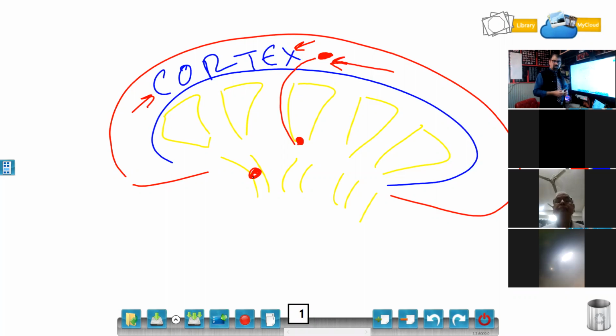You better know that this cannot be a calculus, because the location tells me this is in the cortex, and why would a small calculus be in the cortex? What this can be is a calcification. Yes, why not a calcification? But this can even be a small vessel.